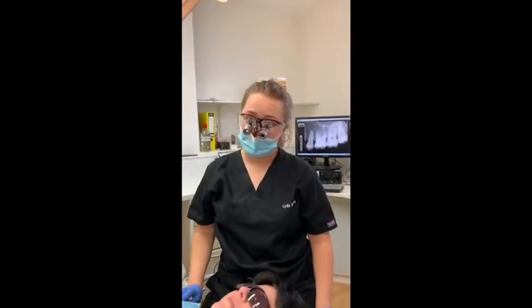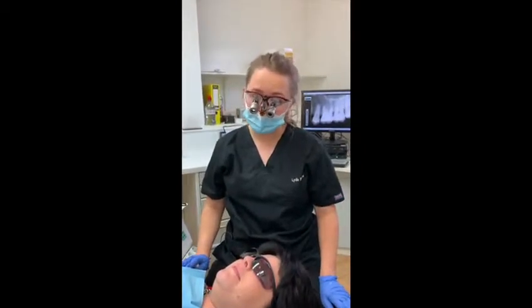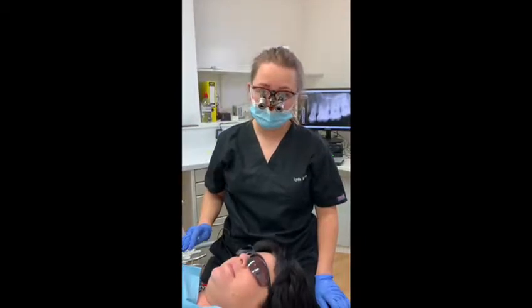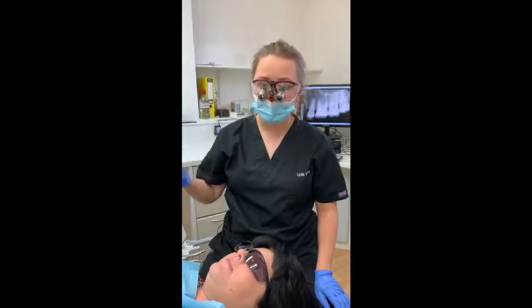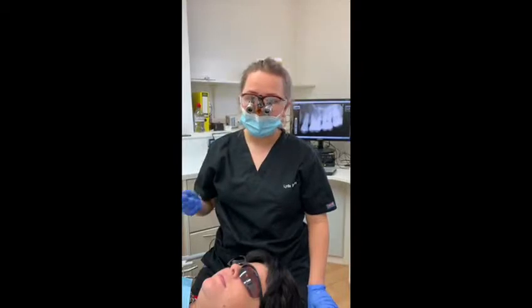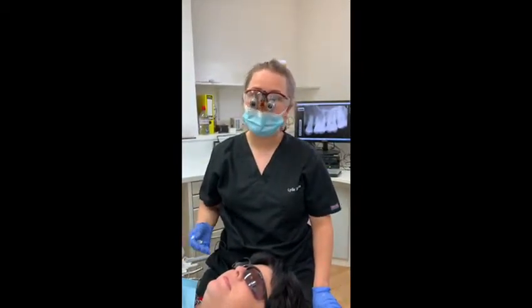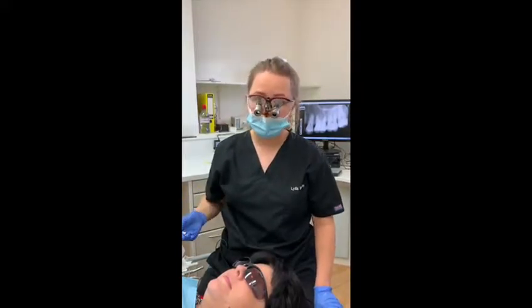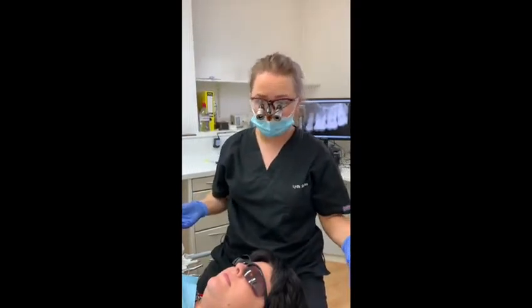Hi guys, it's Dr Lydia Sharples here at Bespoke Smile Marlowe. I've got Amy in the chair today. Amy is our treatment coordinator and unfortunately she's broken a tooth so we need to do a little filling for her. Amy has very kindly offered to be in this video today because lots of our patients who haven't been to see us before are really nervous about having a dental anaesthetic, and we wanted to show you that having a dental anaesthetic can be a completely painless process if we take certain precautions and use techniques that can make it really comfortable for you.